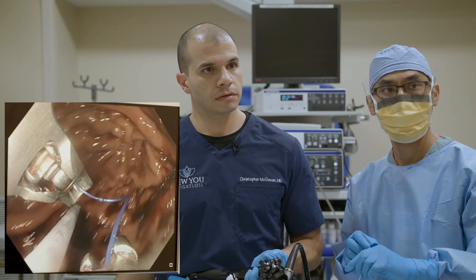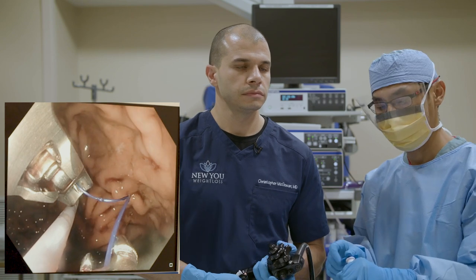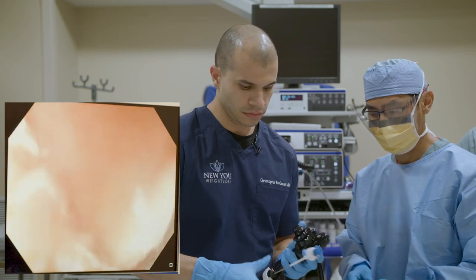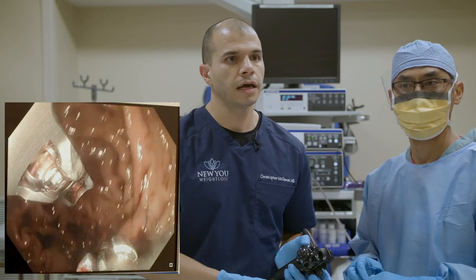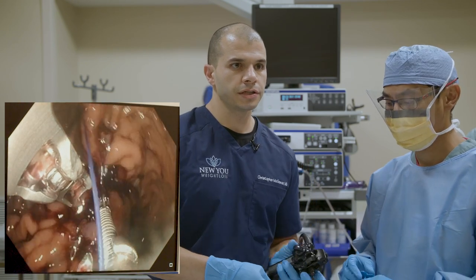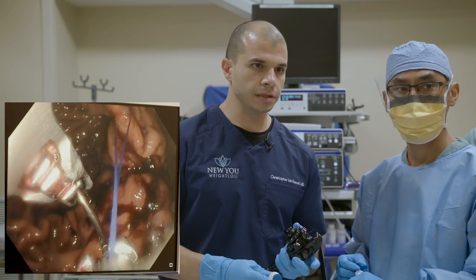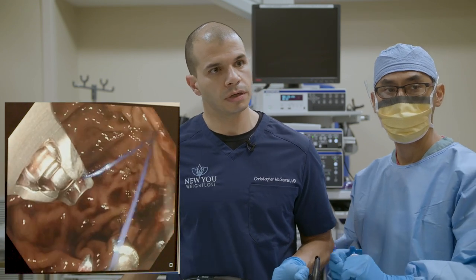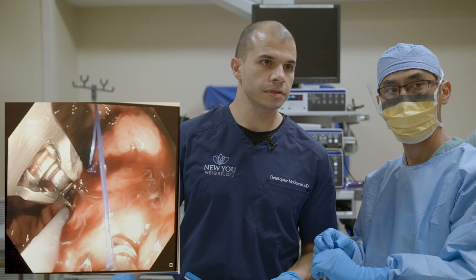We're going to finish with the U-shape — we've got our line right here and think this suture may need one more. As we're getting towards the top of the stomach, the stomach wall gets thinner and thinner, so we're only going to turn the helix maybe two times — we don't want to drive too deep. Roche is always counting in my ear telling me how many turns. We want to actually grab the muscle layer — all the way through the stomach wall.